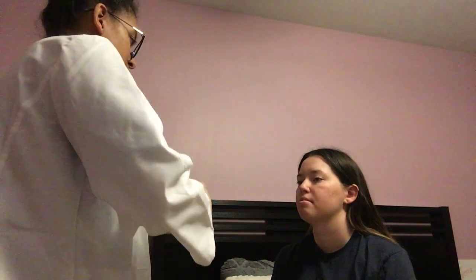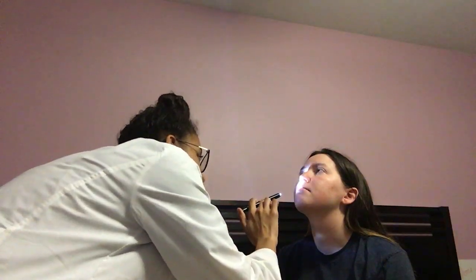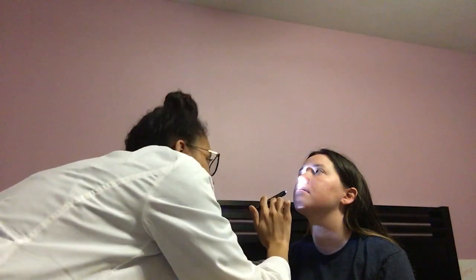And so next we're going to do the nose assessment, and looking at her nose, it appears to sit midline to her face, which is good. So using my pen light again, I'm going to check the inside of her nose to make sure that looks all clear. Can you tip your head back? So looking at the inside of Kaylee's nose, it appears to be pale pink in color with no drainage or runniness and no signs of inflammation, which is good.